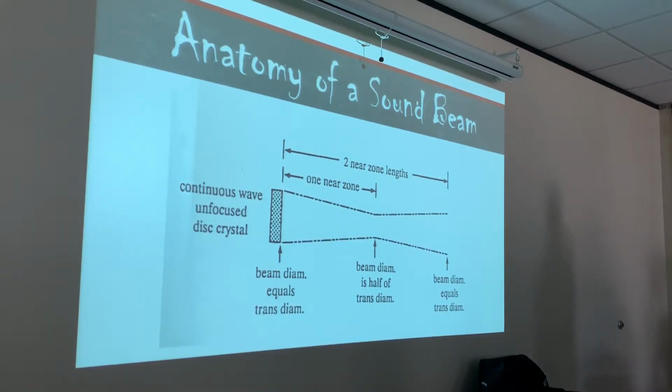Questions? Any questions? Go ahead. This one is only for the continuous wave. Everything we've been talking about so far has been continuous wave, just so we can understand the concept. But the same thing applies with pulse waves as well.